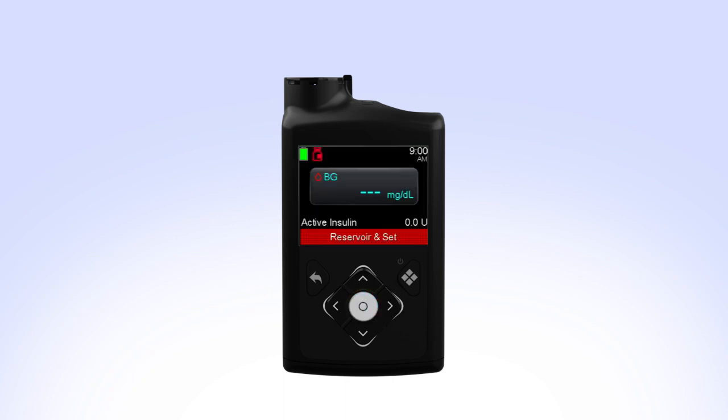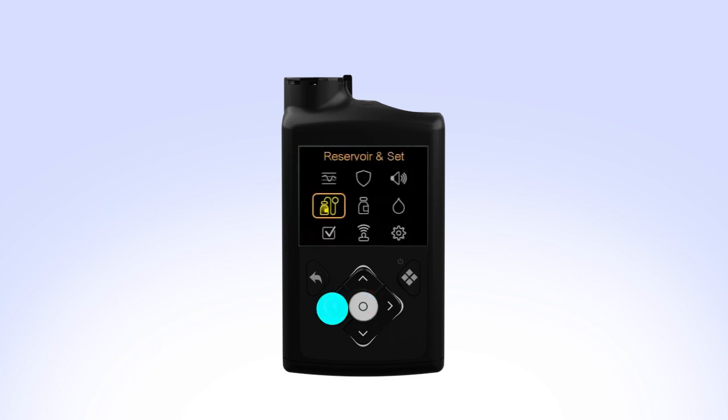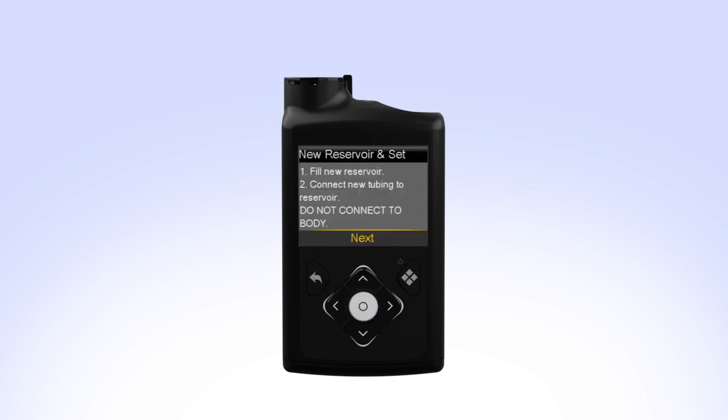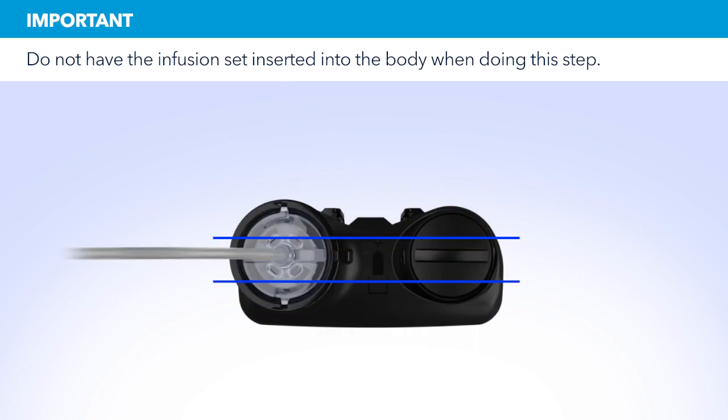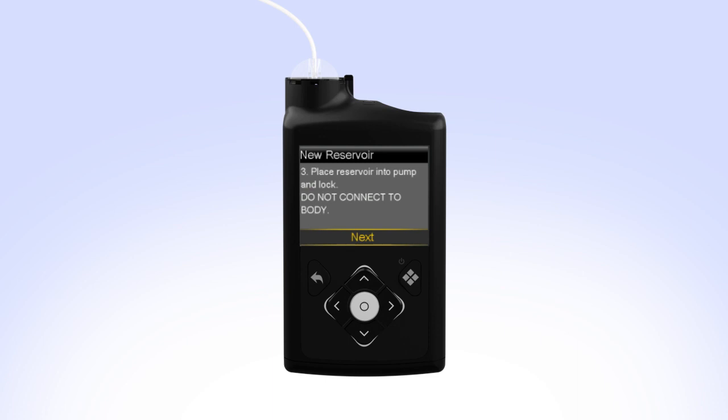While you are filling your reservoir, the backlight may have turned off. Press the Select button to turn the screen on again. Press Select to go to the menu screen and then select Reservoir and Set. Since you have already filled the reservoir and connected the tubing, select Next. Put the reservoir in the pump and turn the tubing connector clockwise until you feel the reservoir lock into place. The tubing connector should line up with the groove in the battery cap of your pump. On your pump, select Next to go to the load reservoir screen.